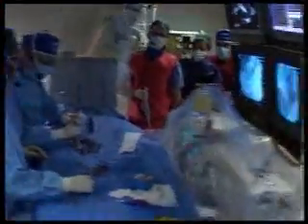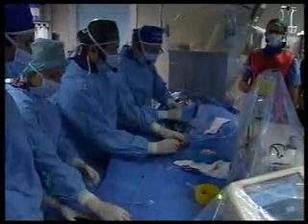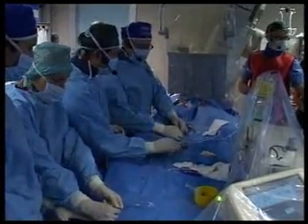You obviously don't soak this in blood. No, we do that inside the body, actually. Well, yeah, that's right.